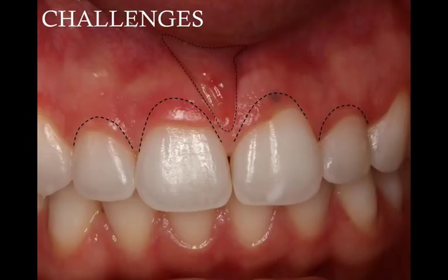Number 1, once we resect the tissue on the teeth, we are very close to the frenum. So if you think about it, this is connecting to the lip. We may get a retraction of the flap. And once we perform the frenectomy, literally we are almost perforating or risking a perforation of the flap. So let's see how this was managed later on.